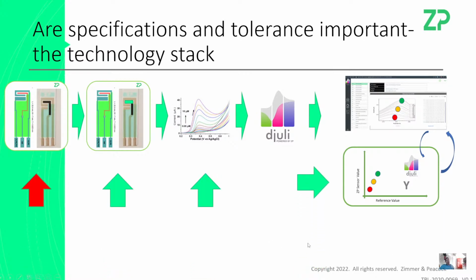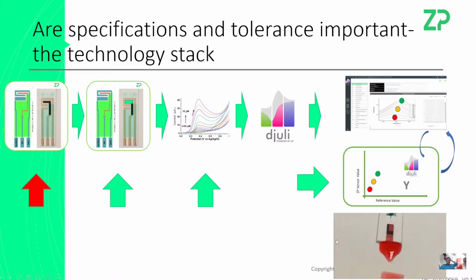And in this one, I realized I left out the idea of microfluidics as well. If you're making a glucose strip, you've also got to consider the reproducibility of the tolerances in the manufacture of that capillary fill.